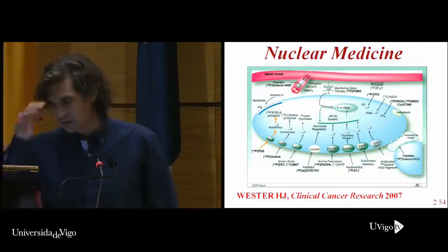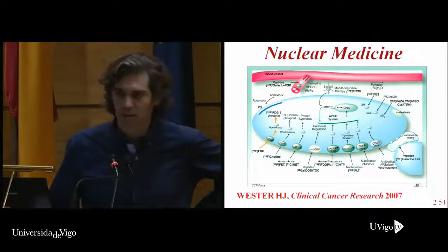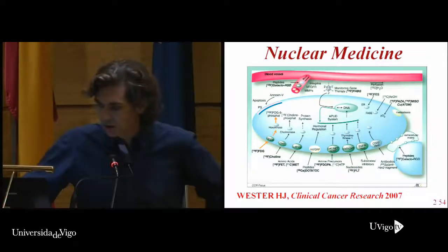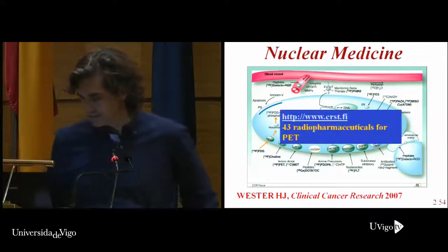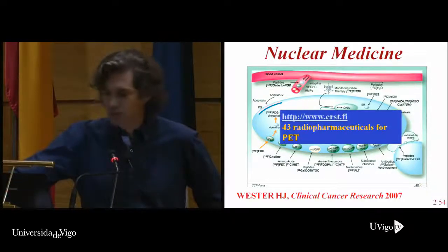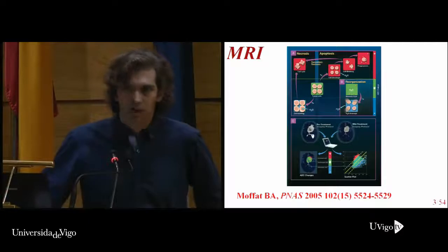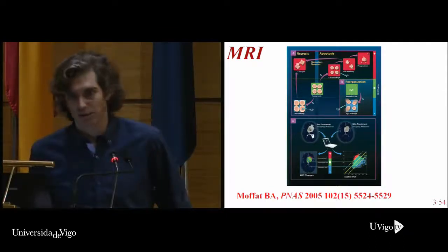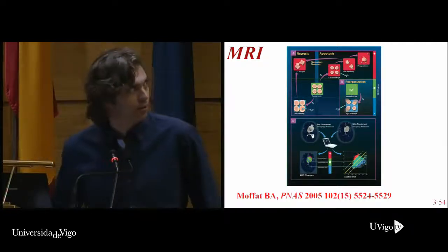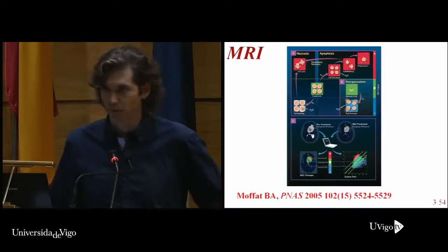In the last few years, a big amount of new radiopharmaceuticals has been developed to shed a bit of light on a lot of human processes, human metabolism associated to a lot of biologic processes. If you look at the web of the University of Turku, you can see up to 43 radiopharmaceuticals for different imaging. And in MRI, also, a big amount of techniques has been developed in the last years to allow us to see the tumor behavior, especially the ADC map, and the dynamic contrast enhanced perfusion and BOLD. I think that those four techniques are the most important for our objective.